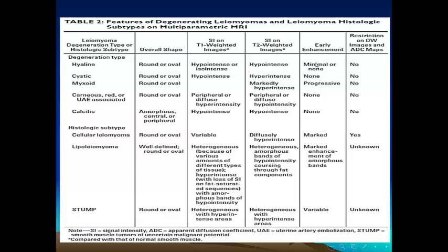If it is just fibroids, as we all see by ultrasound and Doppler, then no problem, we need not inject contrast. But if we suspect that it may be malignant, with rapid growth on your clinical assessment, we must do enhancing, early enhancement.